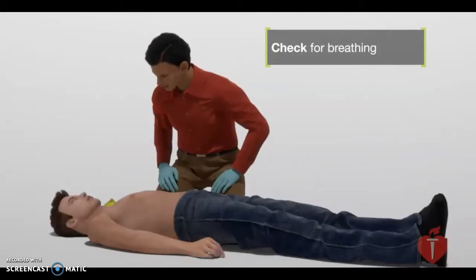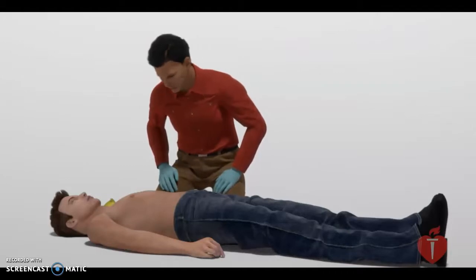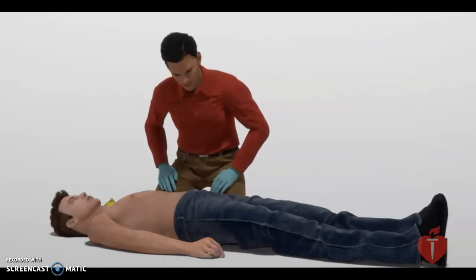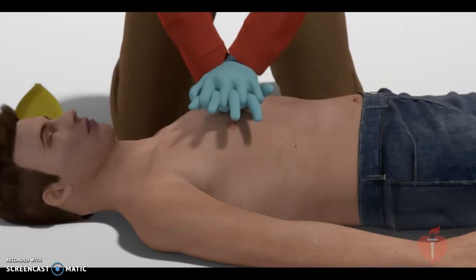Next, scan the chest for 5 to 10 seconds, checking for breathing. If the person is not breathing normally or is only gasping, he needs CPR. Move the clothes out of the way to bare the chest and begin chest compressions.